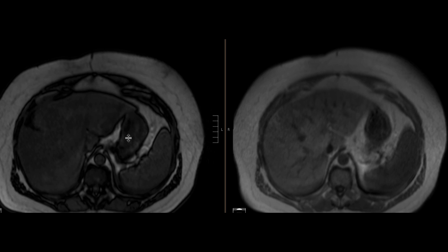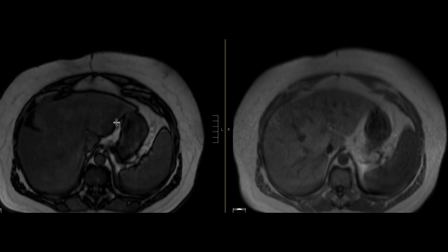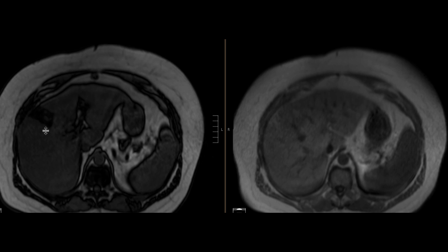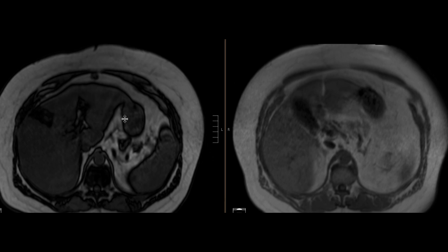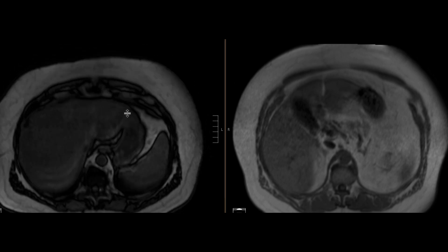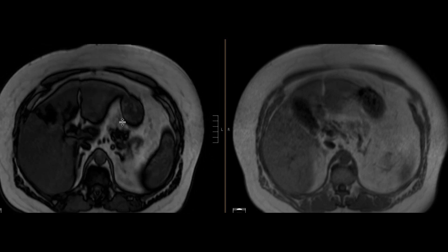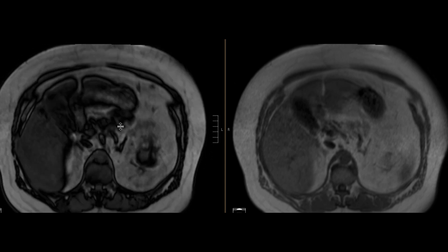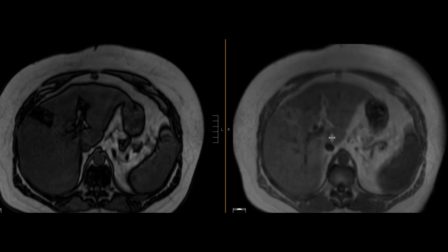So there certainly is fatty infiltration within this liver, and we try to correlate the findings on the CT to what we see in the liver itself. We can see that there's a dark band of hypointense signal on the out-of-phase sequence that's not present on the in-phase sequence, and so all that area we saw on the CT scan is an area of focal fatty deposition in a liver that is otherwise also steatotic. This is a good look for it and is a benign entity for which no further follow-up or work-up is needed.